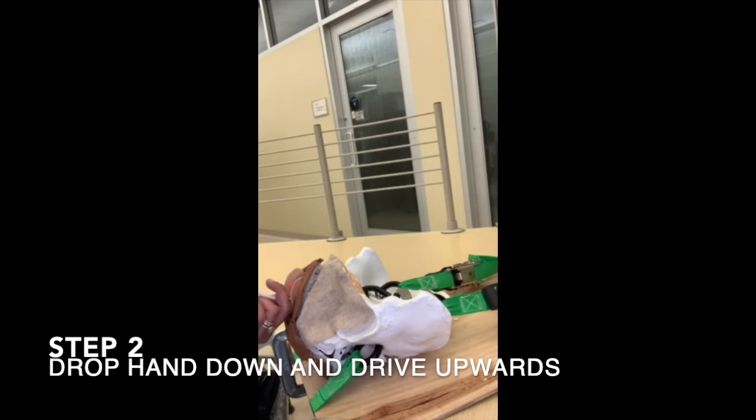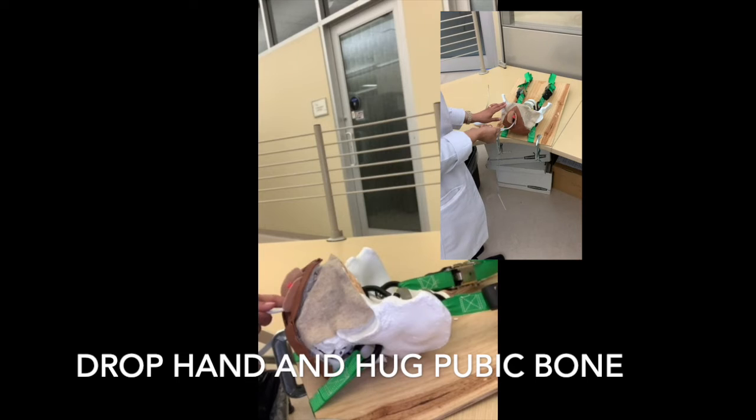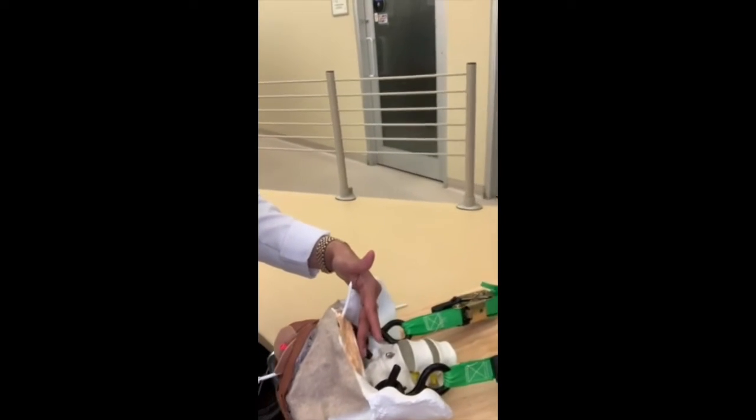As soon as the tip is right under the inferior pubic rami, you keep your finger there pinching your trocar so it doesn't go in further, and you immediately drop your hand to change the angle. The idea is hugging the bone with the TVT insertion. The closer you hug the bone, the less likely you are to perforate the bladder, which is represented here with the styrofoam. And you can see that the trocar is really hugging the bone.